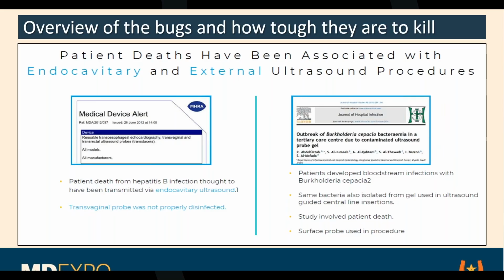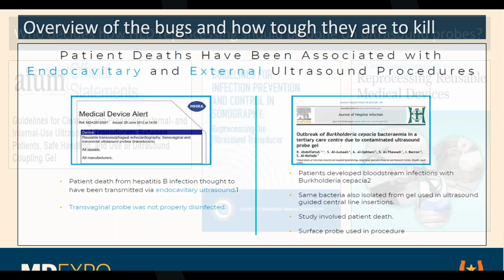And then you get into the practical world, where the clinicians and the sonographers, the ones who actually do the studies, think this is overkill in some clinical uses, so they want to do it differently from the way the FDA does. But that can lead to a lot of extremely interesting things happening to probes, to the point of just blowing them up. So we'll take a look at that and see some examples. It'd be kind of fun for us, not fun for the person who's responsible for it.